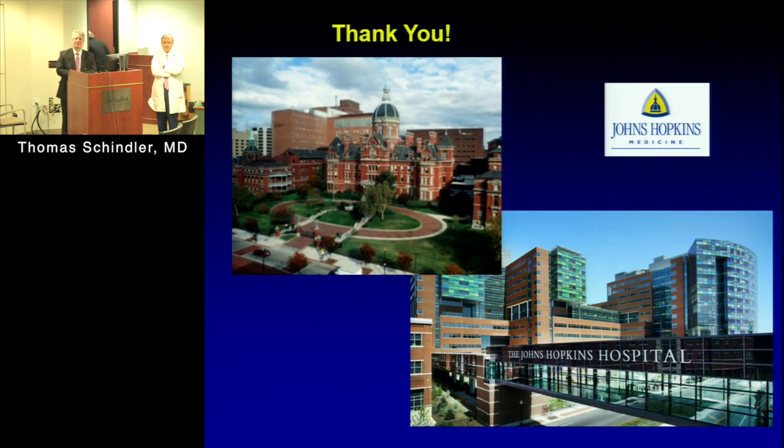Now, there have been biopsy correlations with MRI, and the current studies show that EP guidance to biopsy is actually more sensitive and specific, even compared to MRI, like the inflammation that shows in MRI. We have a couple of cases here where we did EP-guided robotic biopsy, and when we directed to the MRI inflammation, it didn't pick up. The EP scar picked up the sarcoid granuloma.